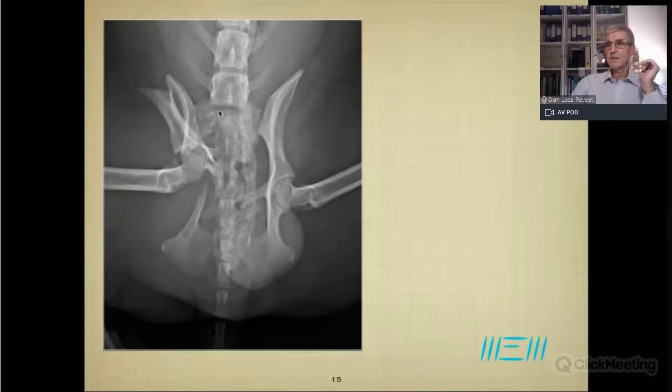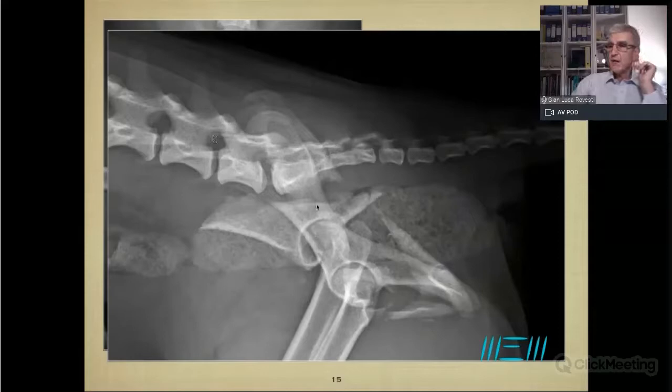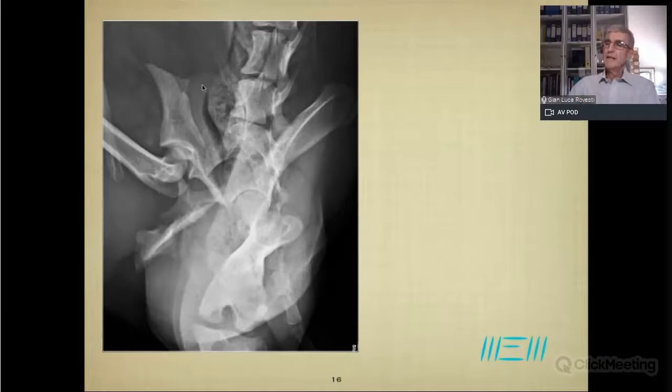This is the other projection, the lateral projection. As you can see, it is a long oblique fracture, a difficult one even with plates. Why? Because with plates here, in most cases the plate axis will follow the axis of the fracture. So it's not always easy with straight plates to have the correct angle that is capable of effectively stabilizing this kind of fracture. If I want to understand more properly the shape of the hemipelvis fracture, I can usually use oblique projections on the axis of the hemipelvis, in order to better understand exactly where the fracture lines are.